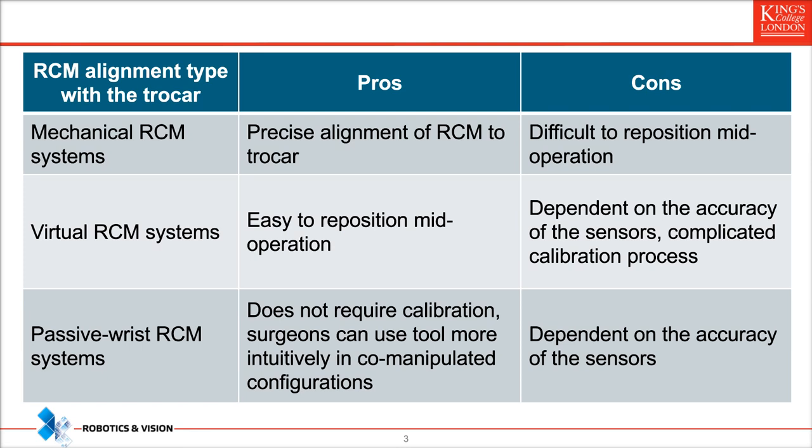Due to the precision required in vitreoretinal surgery and to ensure the safety of the patients, if robots using either the virtual or the passive wrist RCM configurations are to be used, they require a method for real-time RCM estimation that is robust against noise. These two types of configurations are the ones that we have focused on for the study.